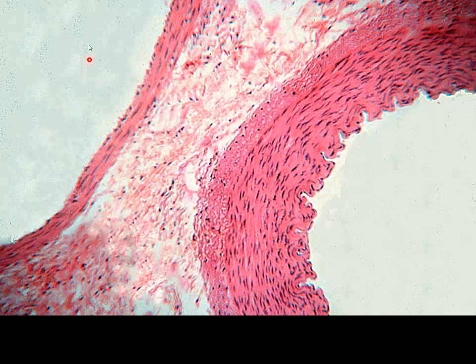Over here, again, we can't see the entirety of this vessel. This is an inset from the previous illustration. So from that, we know we have an extremely large lumen. We do have some smooth muscle, so we are looking at a vein.